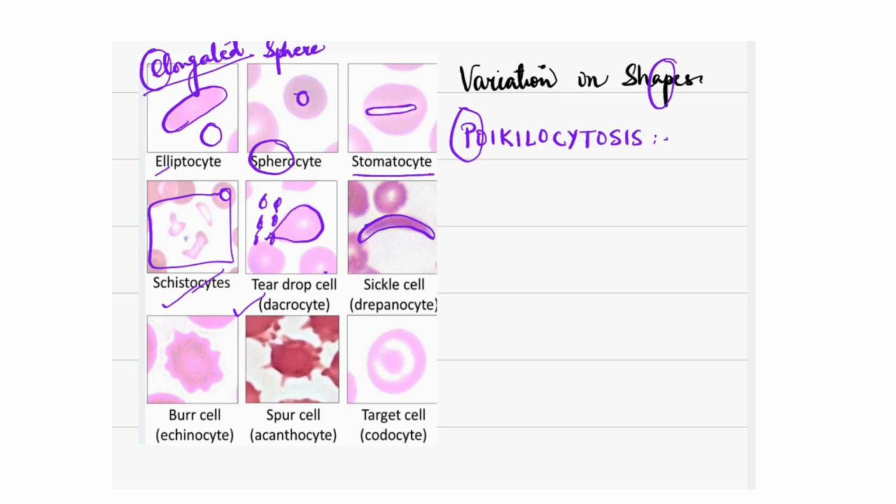Yeah. Now a sickle cell. Sickle cell, like a tool in farming we use to cut the grass. It's like this, a sickle, to cut the grass. Okay. So sickle cell, exactly that shape. And we have a term, sickle cell anemia, for it. Okay. One important part about sickle cell anemia, it provides a little protection against malaria. So this is something which you should know for your exams.